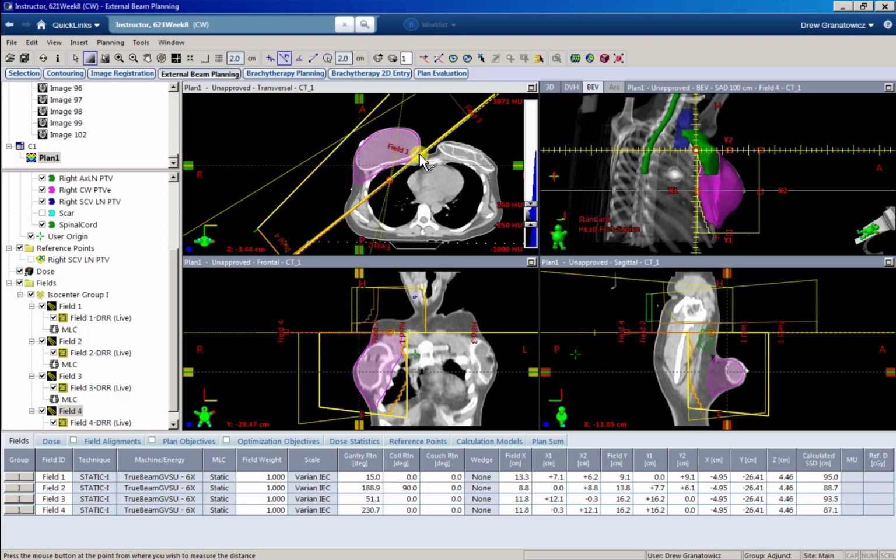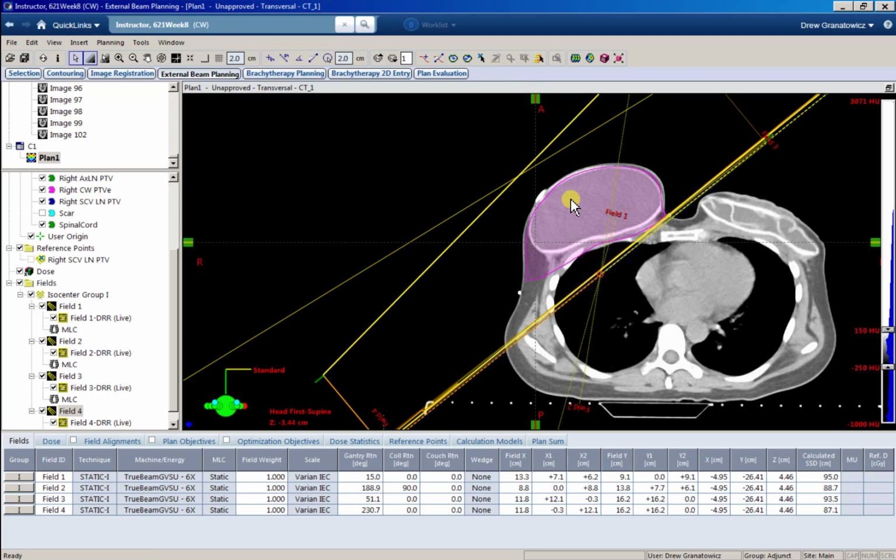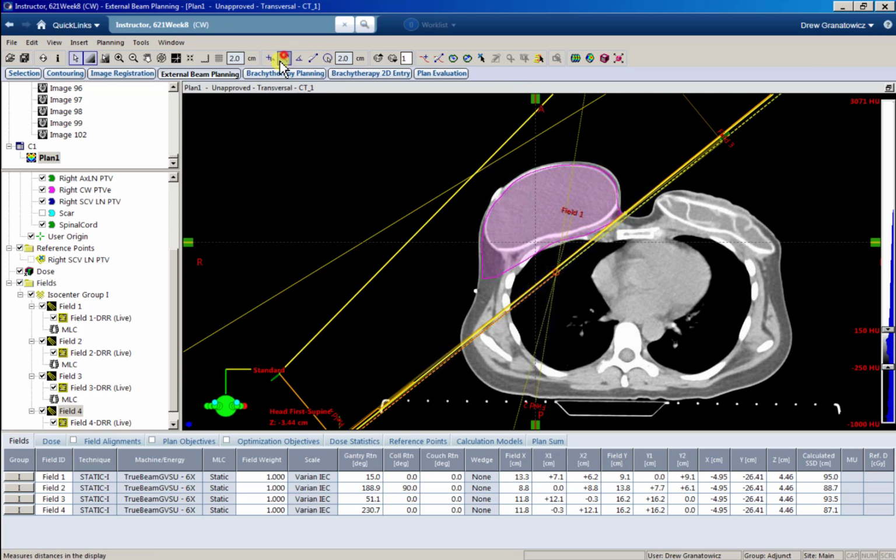All right, so on a chest wall, the point is we're going to try to treat the skin and also the deep tissue, the actual chest wall. So we want to try to use as much low energy as we can, but just like with the normal breast, if our separation gets too high, 24, 25 cm, you might have to sprinkle a little bit of higher energy in, but you want to do that as little as possible, because the idea is to treat the skin and that very external bit of tissue.